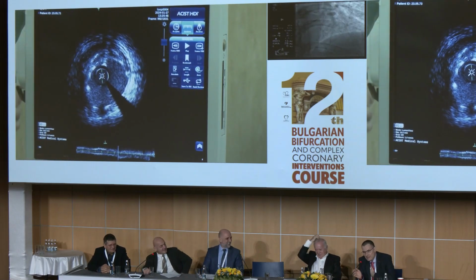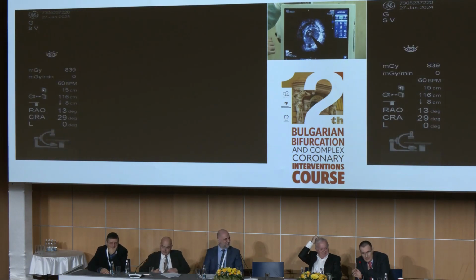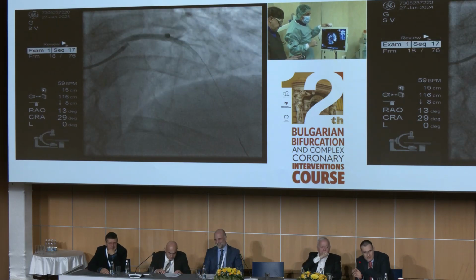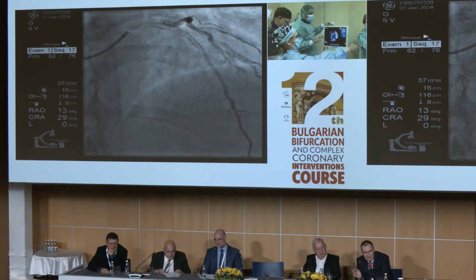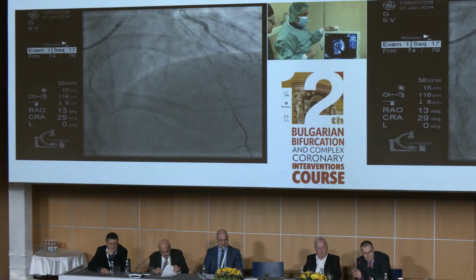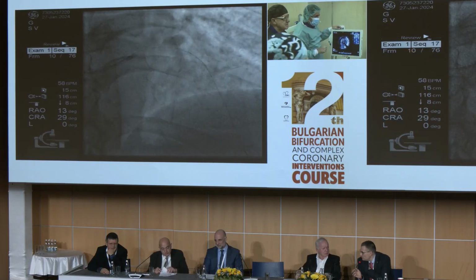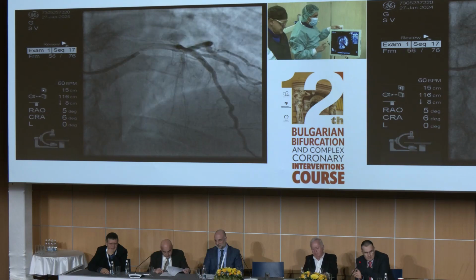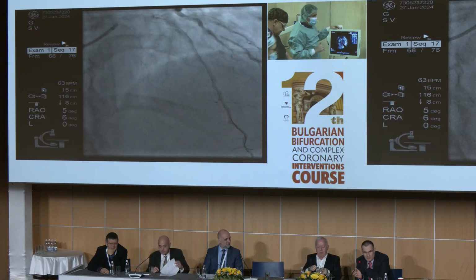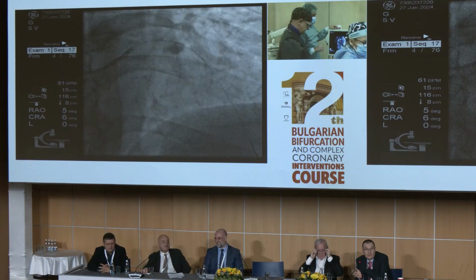Guys, let's see the angio and proceed with the lecture of Dr. Avramovic about the X-ray protection. The Pocky technique was published in Cardiology Journal in 2022 in a series performed by Robert Gill, who was also participating in this meeting, and Professor Vasilev. I find it an extremely smart solution. Thank you, Juan, thank you for the advertisement. Now, Dr. Avramovic, please.